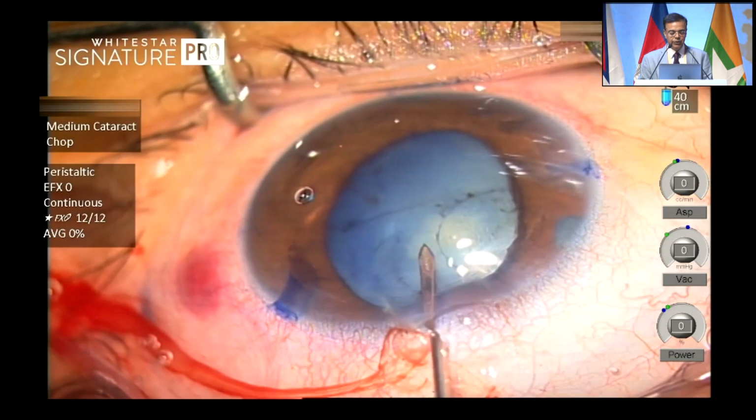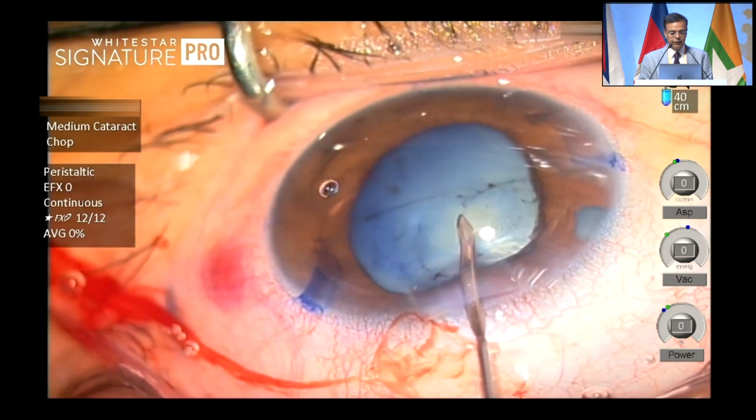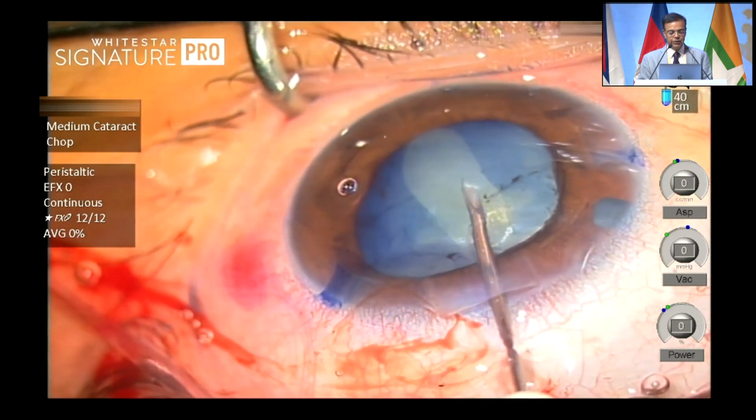And now, because it's a very intumescent cataract, I want to decompress this lens. So I'm going in with a 26 gauge needle on a 1 ml syringe. I will puncture it and try to aspirate whatever I can very quickly. So please keep watching, and that's the plan. And the moment I touch it, it just goes into the Argentinian flag sign.